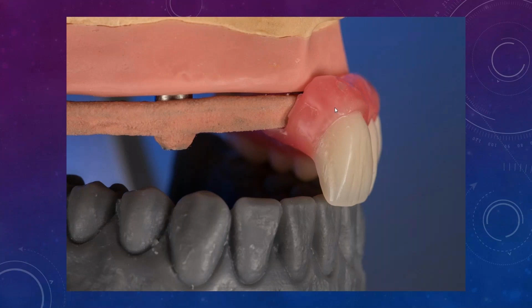The majority of the fractures that I see patients getting happen when they're deflasking. So when you deflask your cases, you have to deflask them a little bit differently. I'm going to show you guys how to do that in a minute. Okay, I'm going to explain it to you. So just something to be aware of.